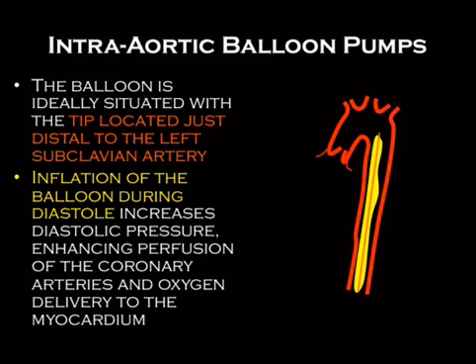So the way that these things work is they will inflate during diastole, so like this, and then as the blood goes through, it gets forced back into the coronary arteries and helps perfuse the heart.